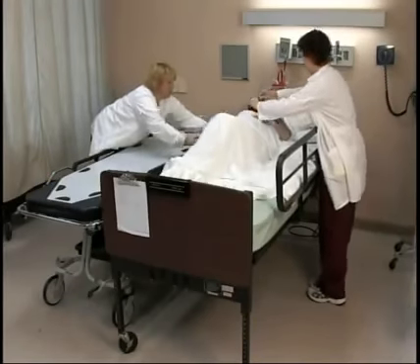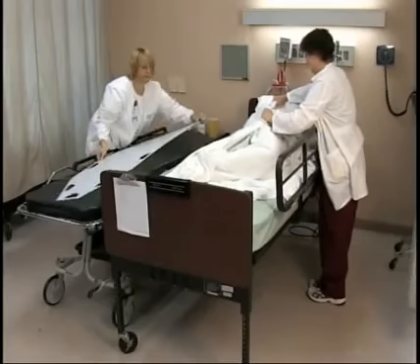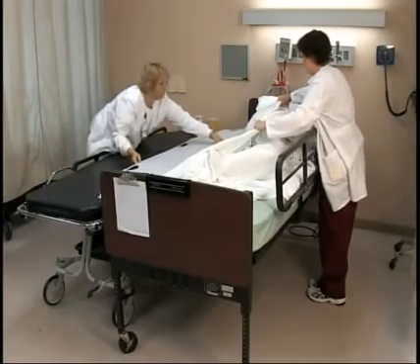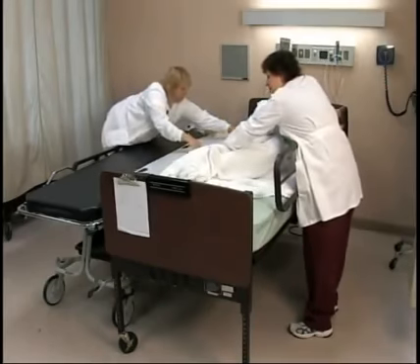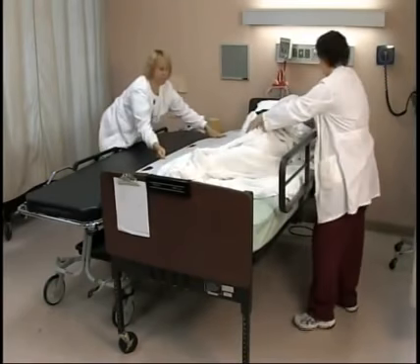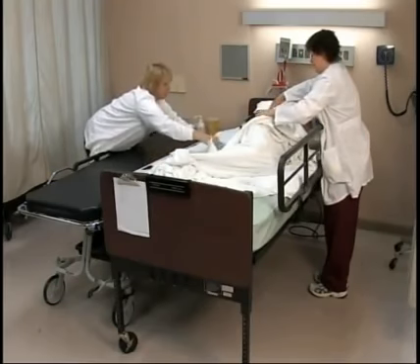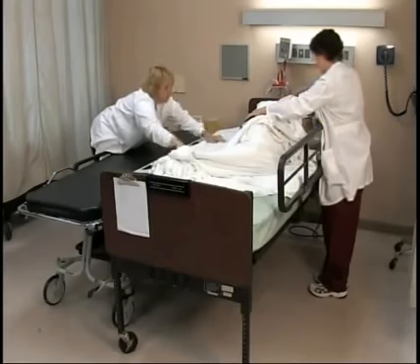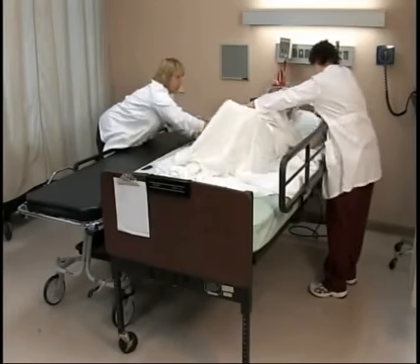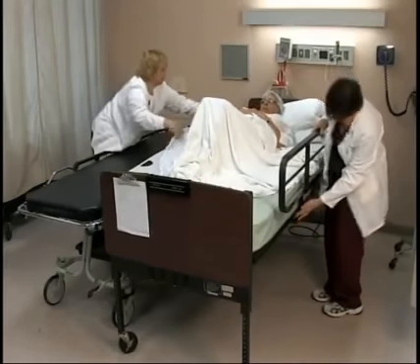Roll the patient away from you, keeping the opposite side rail up. Place the slide board under the patient and bottom sheet, making a bridge between the bed and the stretcher. Have the patient roll back and position them on the sheet. And put the other side rail down.